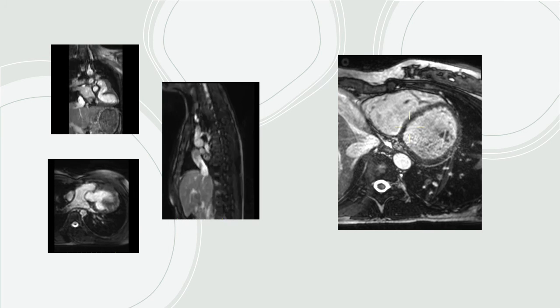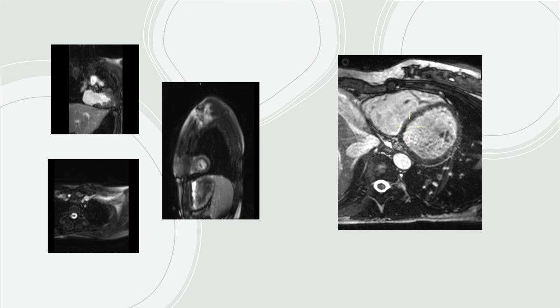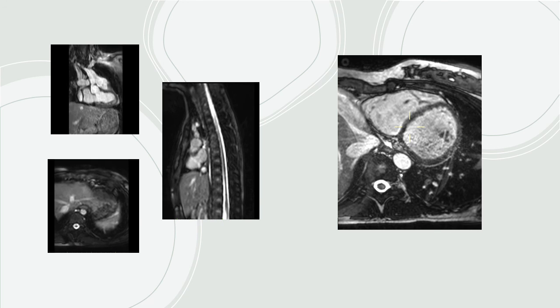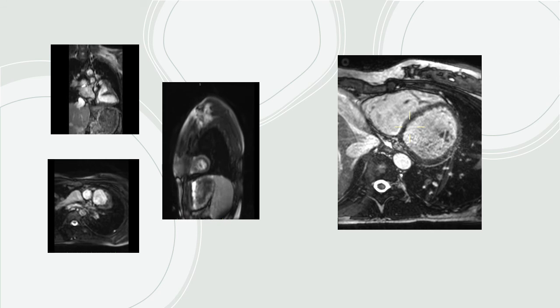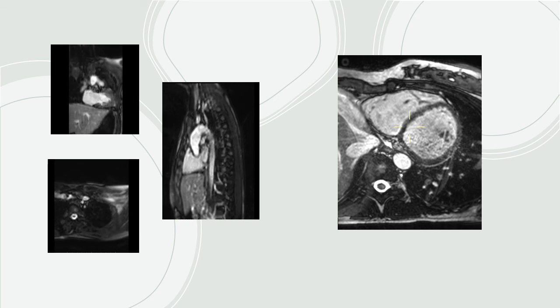Here are a couple of examples of our low resolution and high resolution 3D cardiac images. On the left hand side is our low resolution. As you can see, it's vastly improved from what I had shown previously. And on the right hand side, interestingly enough, without contrast, is our high resolution, and this is the quality that's needed to be sent off for 3D printing.